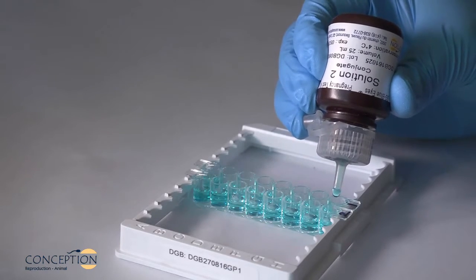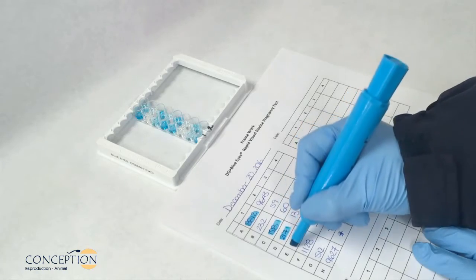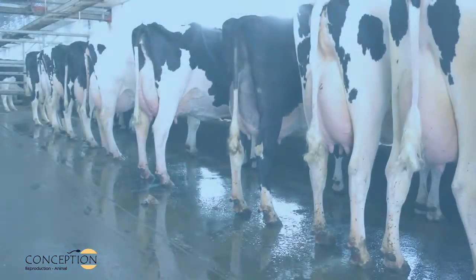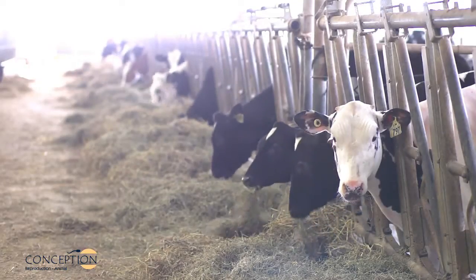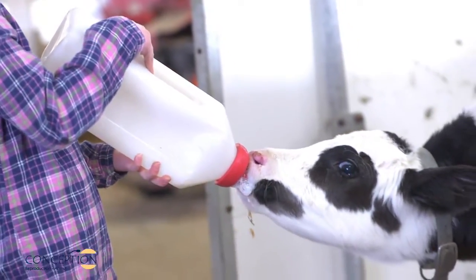DG Blue Eyes is a visual and rapid test for the early detection of bovine pregnancy. It can be used both in the laboratory and on the farm without specialized equipment. The DG Blue Eyes test allows rapid identification and rebreeding of non-pregnant cows and heifers, thus improving the reproductive performance of the herd.